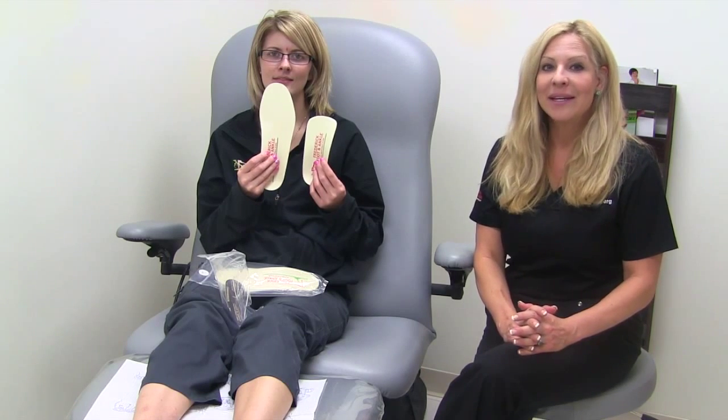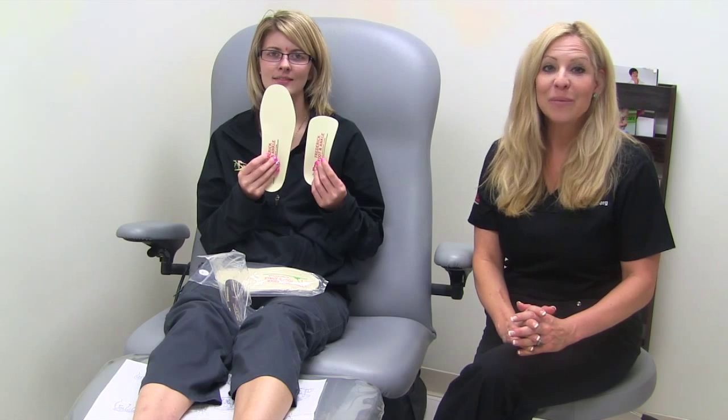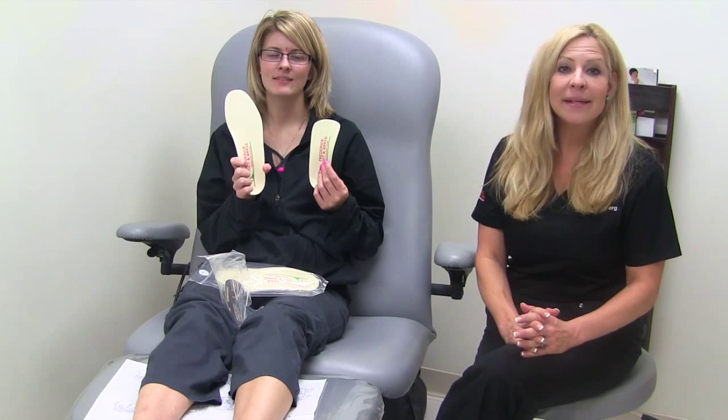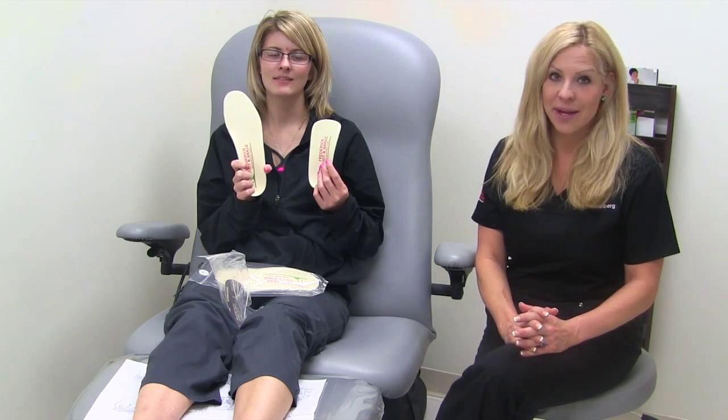This is a conservative treatment to help your foot function more efficiently. The semi-custom orthotics feature a lifetime guarantee, never to break, crack or bottom out. And this comes with all of Dr. Jill's orthotic shells.